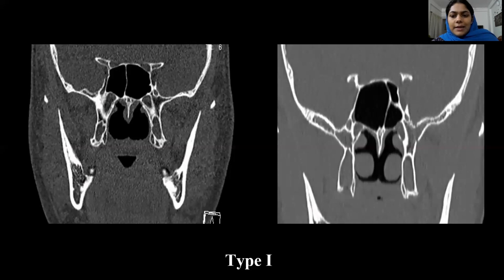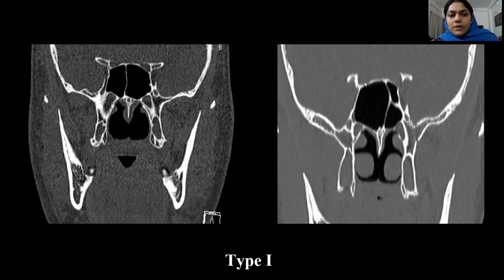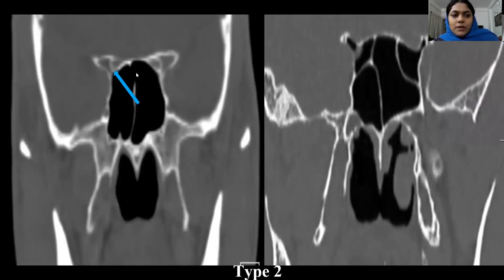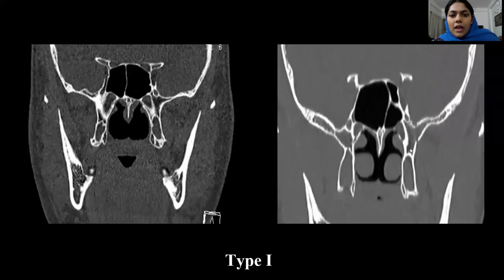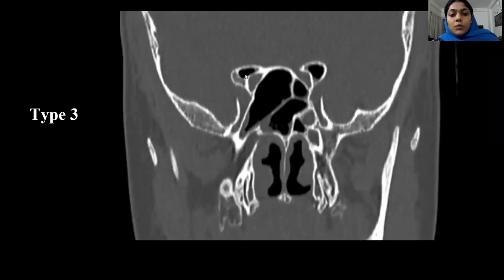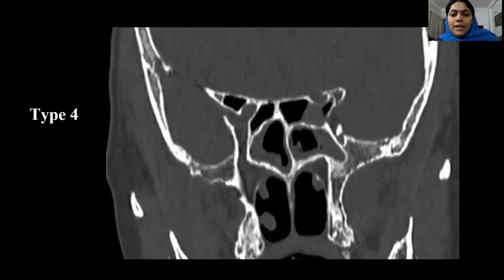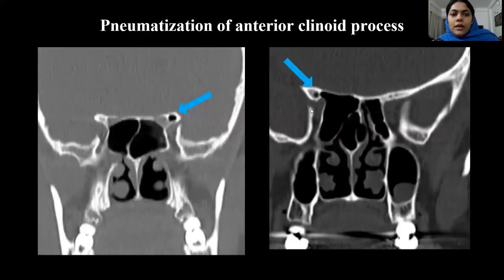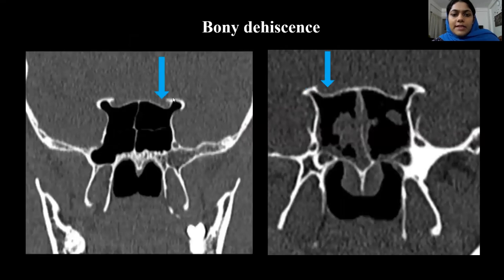We can see type 1, where the optic nerve is seen adjacent to the sphenoid sinus on the right side. Next is type 2 with mild indentation, less than 50% indentation. And type 3 with more than 50% involvement surrounding the nerve. And type 4 with bilateral Onodi cells, and we can see the pneumatization of the anterior clinoid process and the bony dehiscence and thinning.